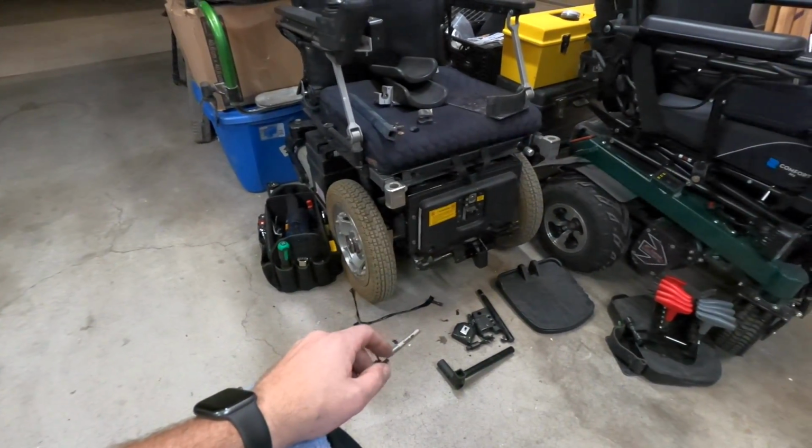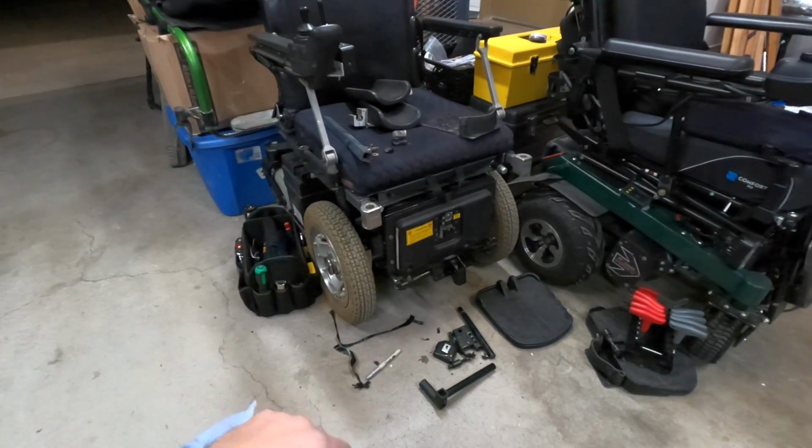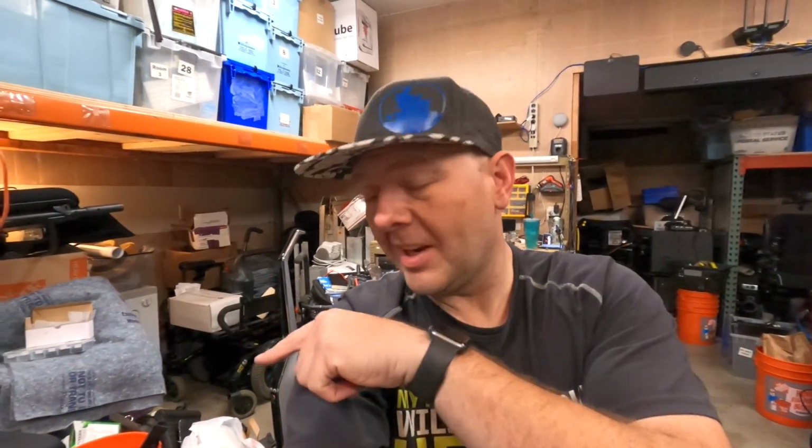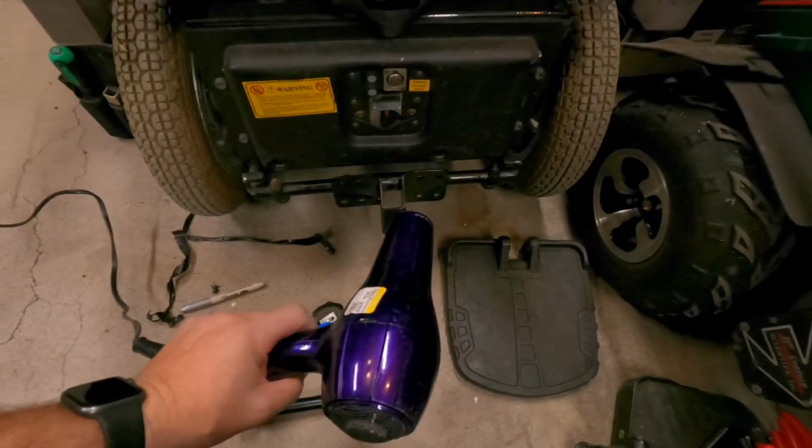I'm not sitting in this thing all day. And also when you tilt, obviously your legs are going to get further away from the leg rest, but I think for the time being right now, it's at least going to make it more usable, and I don't have to get out those foot plates and worry about pinching my fingers and all that stuff. So yeah, it'll make it into a usable thing I can just hop in, go run around if I want to, and yeah.